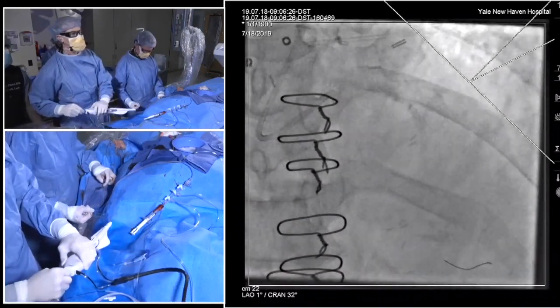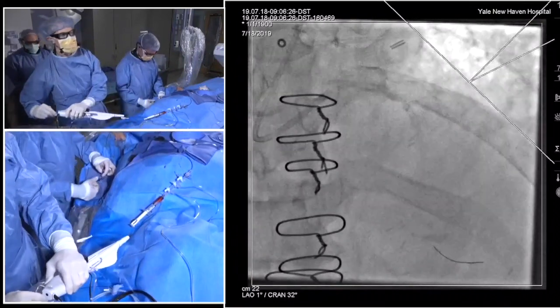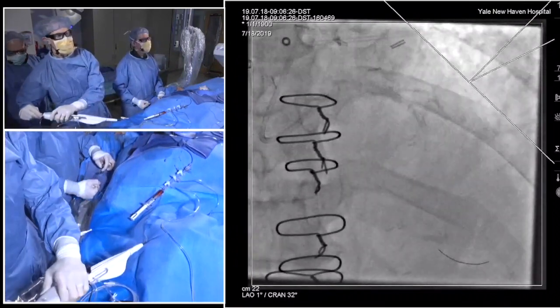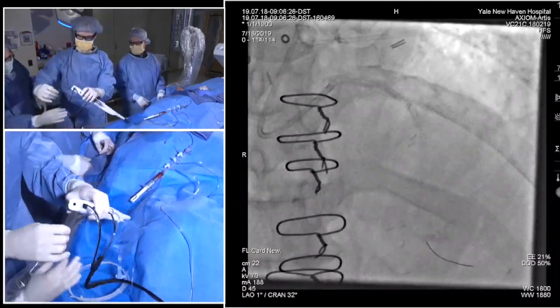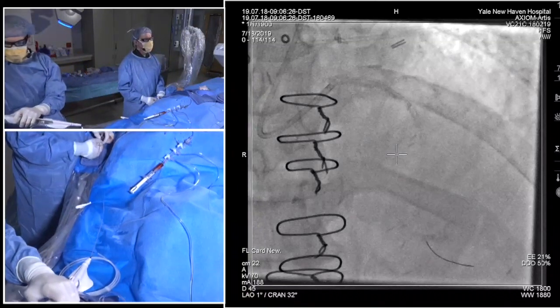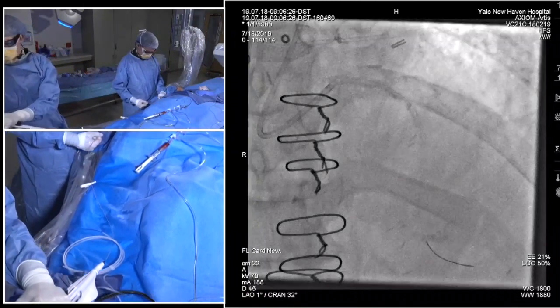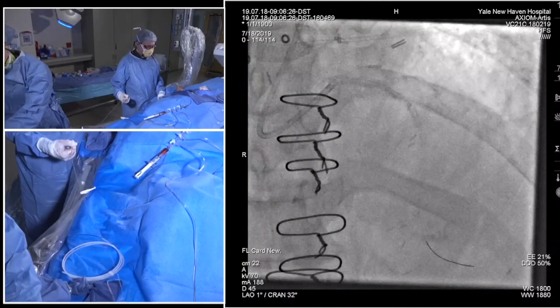Now, for the taking out part, what they've done is they've gone on Dynaglide. The left-hand thumb of the secondary operator is holding the brake to defeat it, and typically the easiest way is to advance the wire, and the thing will come out in that way. So really, the idea here is not to ablate all the plaque, it's to modify it so that then the balloons can do their work when you go back with an NC balloon and crack it at that point.